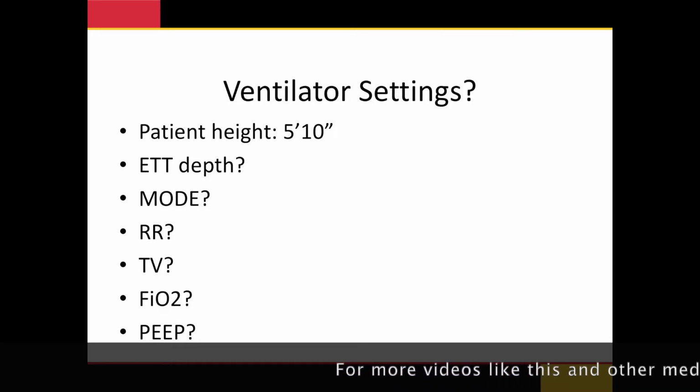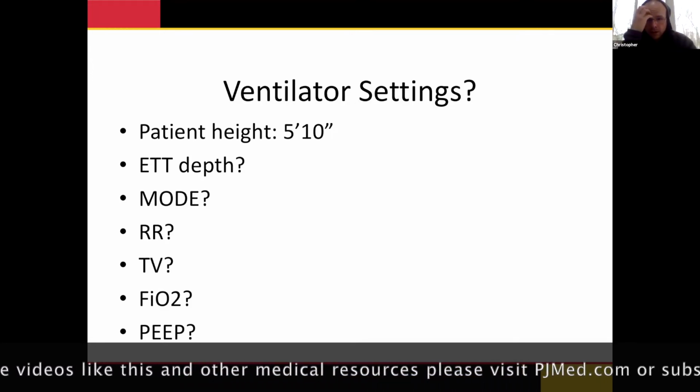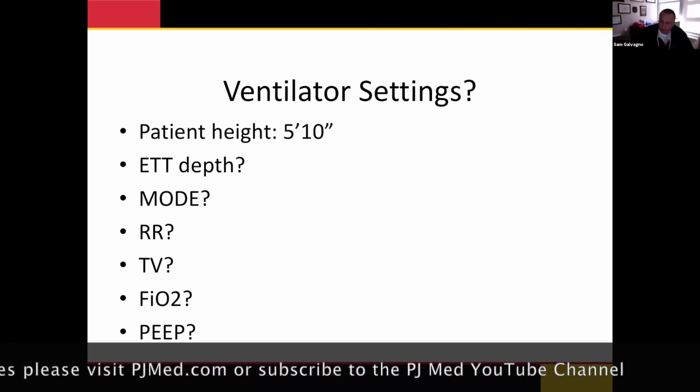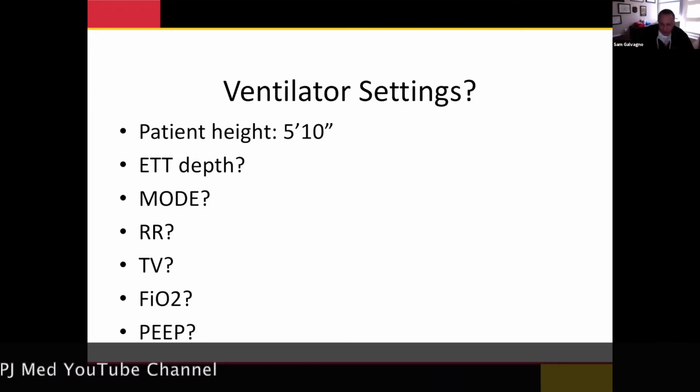Because I think tidal volume is usually based just off of height, and then if the patient's more obese, then you might need a higher PEEP. Yeah, good answer. I'm, again, not trying to pimp you. I think you knew the answer. That's why I wanted you to communicate that to your colleagues.